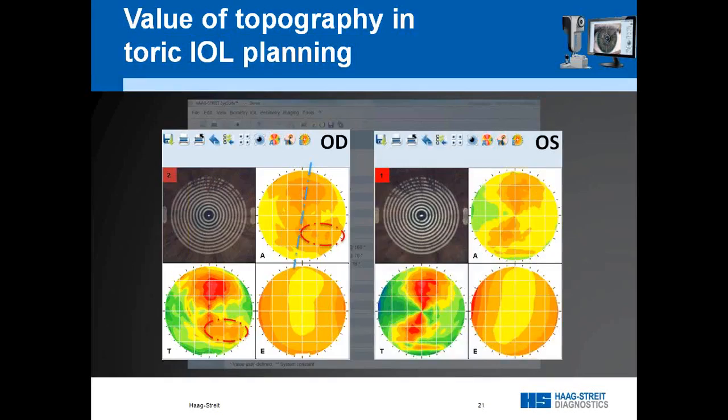Similar image, but it goes a little bit worse. First double check the axis. Again, if we draw the line to the bow tie, the 80 degrees look very reasonable. But if we look a little bit more closely at the lower slope of the bow tie, we see that the lower slope actually bends away about 10 degrees as compared to the upper slope.